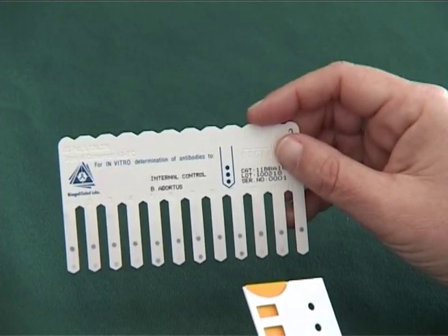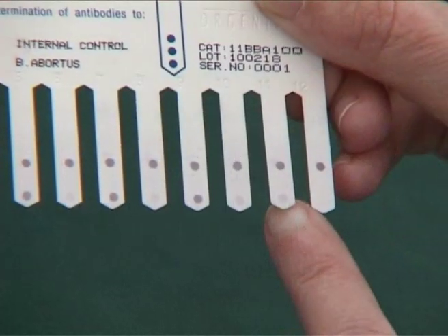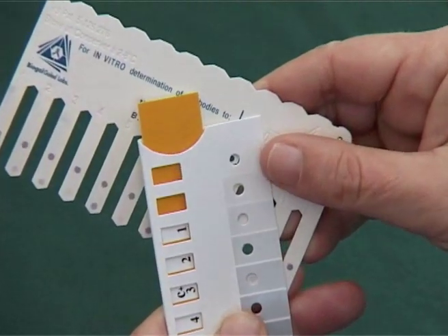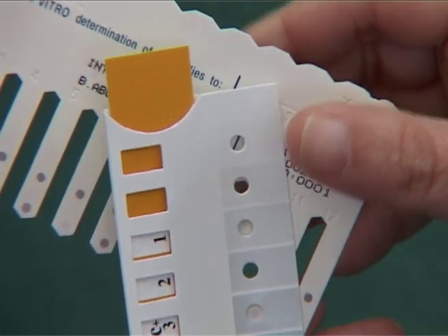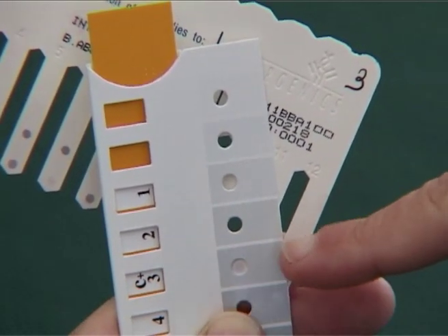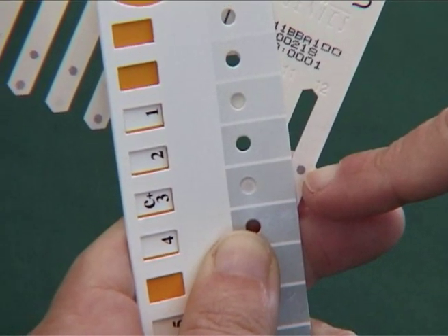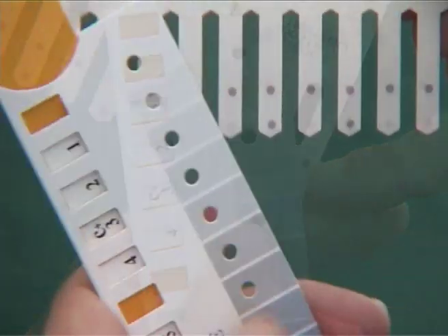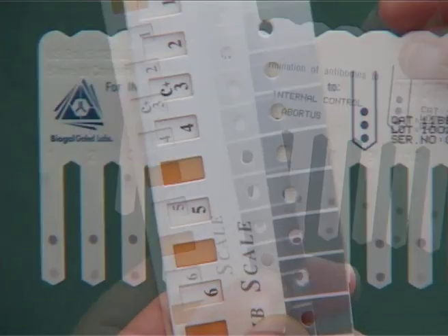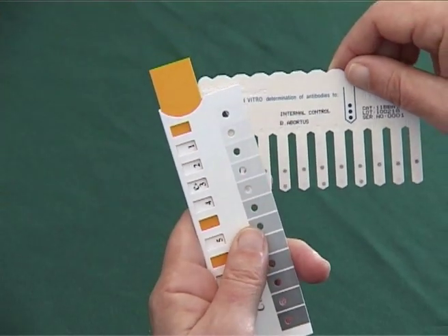When the comb is completely dry, align the comb scale and compare the color obtained with the positive control color scale. Slide the slider until C plus 3 appears in the window. Hold the slide in this position during the reading of the sample, choose the most suitable color, and read the titer in the yellow window.